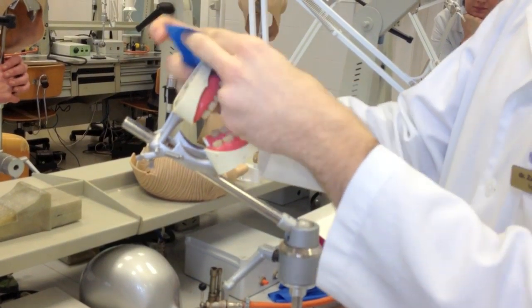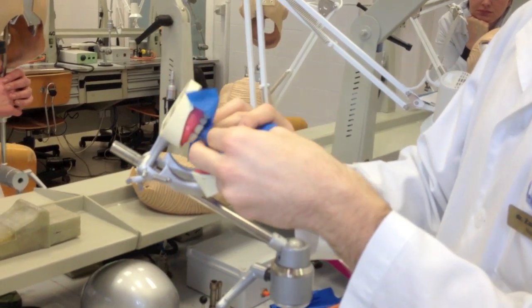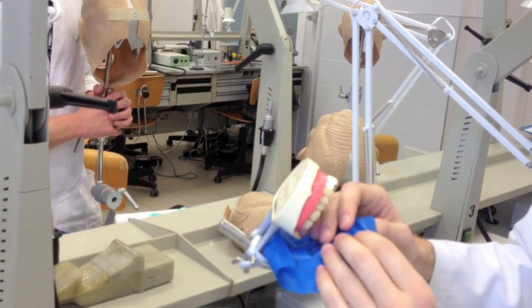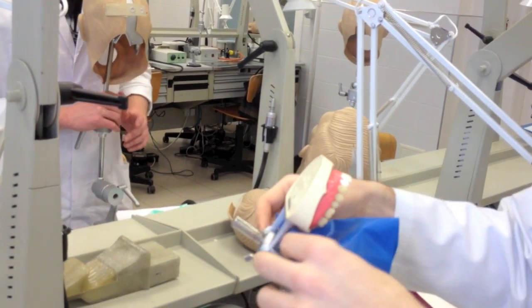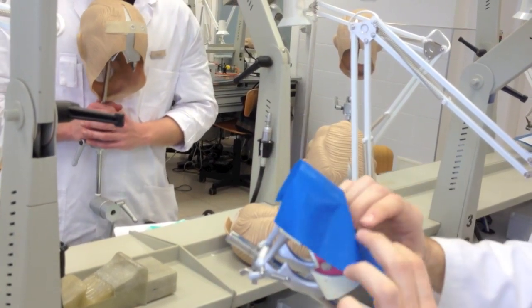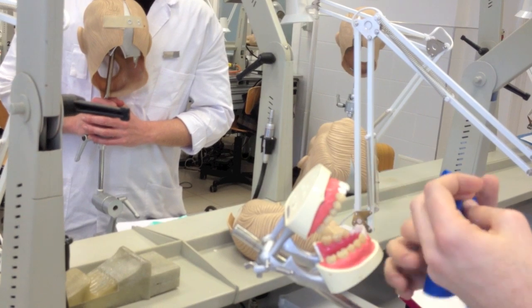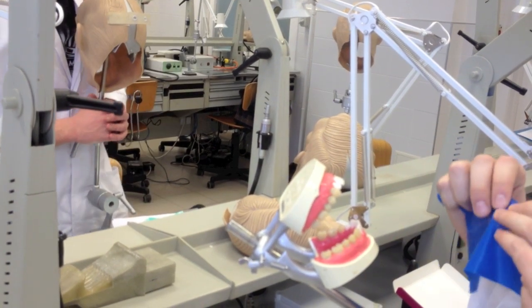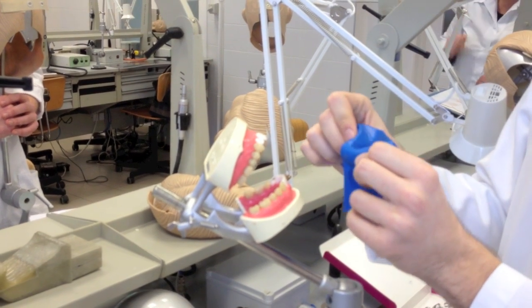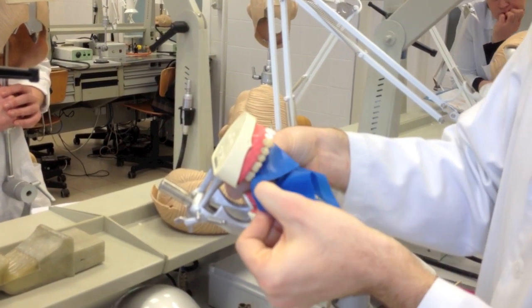First the rubber, then the clamp. It's always a good idea to have an assistant. In this case you don't have to use an assistant, because now I can place the rubber on the model. But in a real patient, the assistant can hold the upper corners so you can work more easily. The best way is always to place the rubber dam on the most distal tooth — in this case we will place it on the seven.